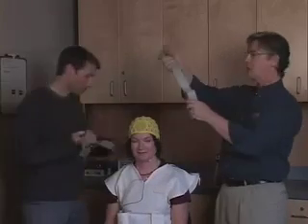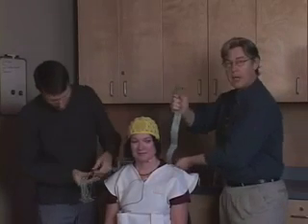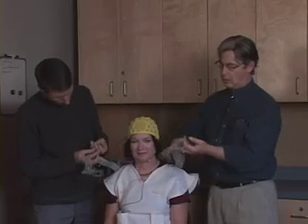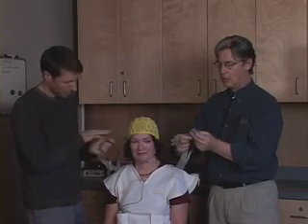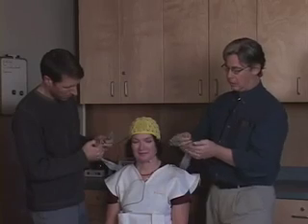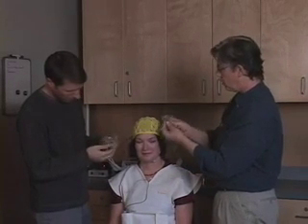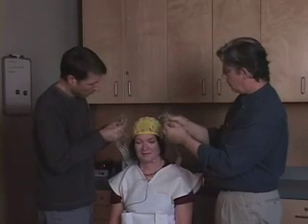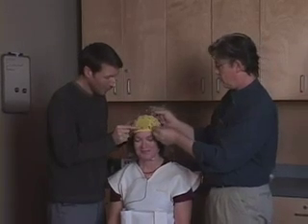And we give ourselves a bit of slack with the ribbon, and then place the ribbon back into the container in the vest. And then we go through methodically. All of these electrodes are numbered. And so we begin with number 1, and we just move forward. They pop in very lightly. Kate, are you feeling any pressure? No, it's fine. It's okay.